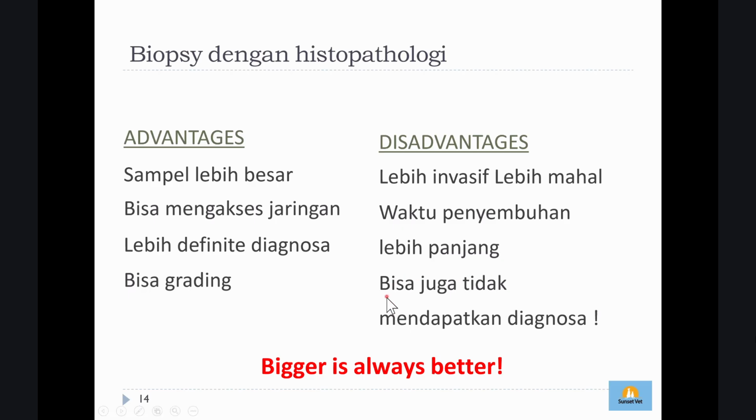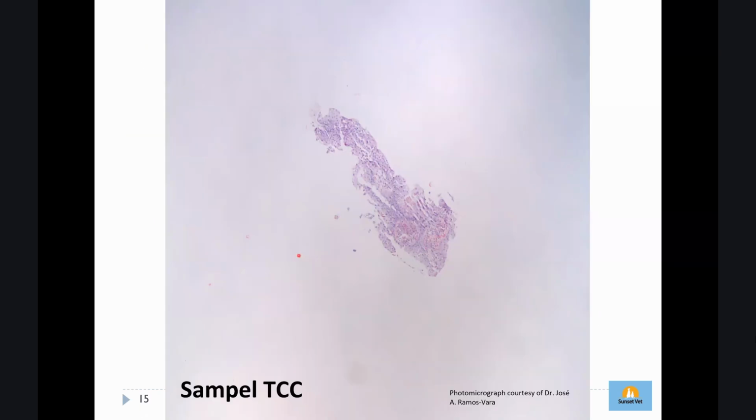There is also a possibility that you would not get any diagnosis if you do not get a proper sample. This is the thing you need to make sure of, that you get a good sample. Okay, this is a sample of TCC, transitional cell carcinoma, from the bladder.